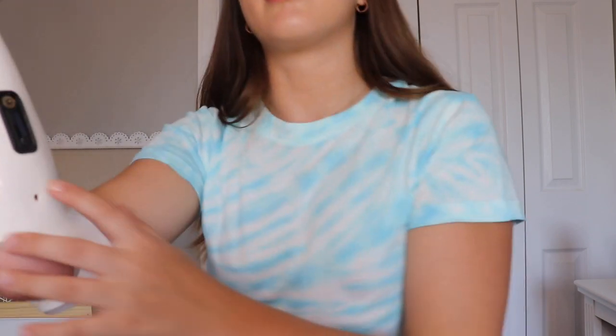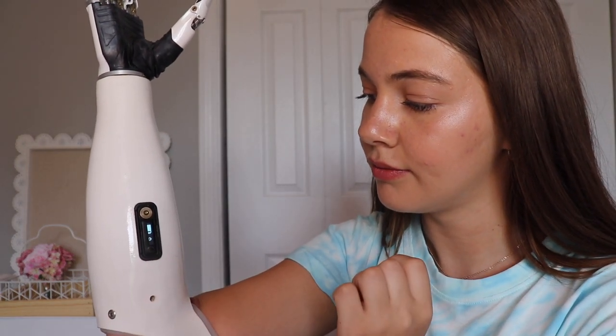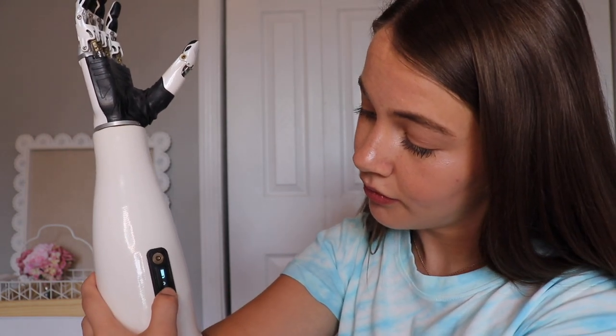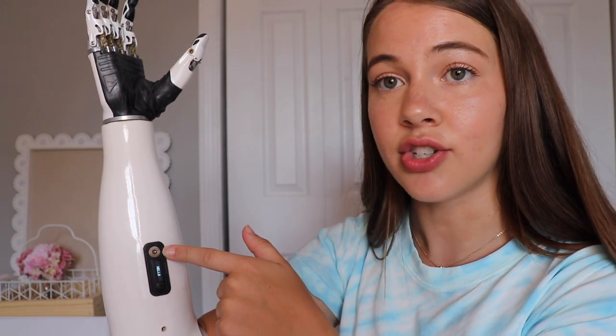Now that the arm is on, you can see that there's a space for my elbow so I can bend the arm and straighten it. And then this here latches onto my arm so that when it's upside down, it doesn't fall off. Right here is where I turn the arm on. It shows me how much battery I have left, and usually the battery lasts about the whole day. This is also where I charge it.